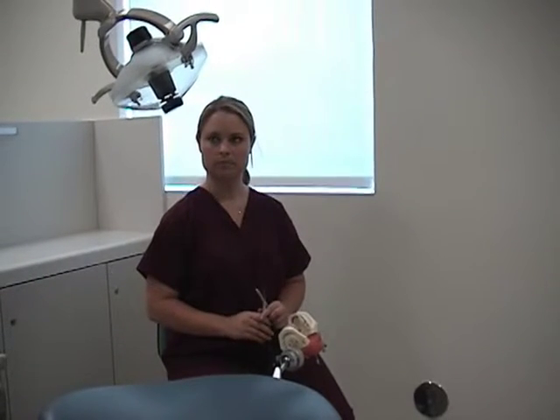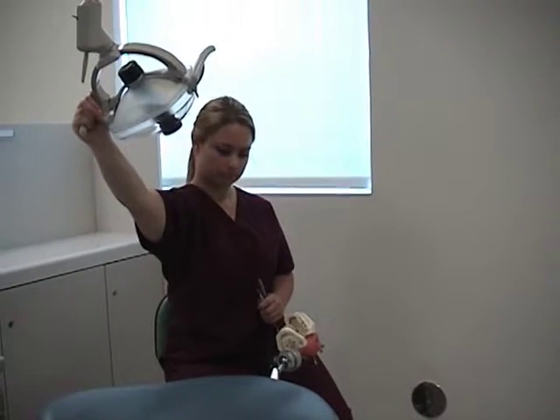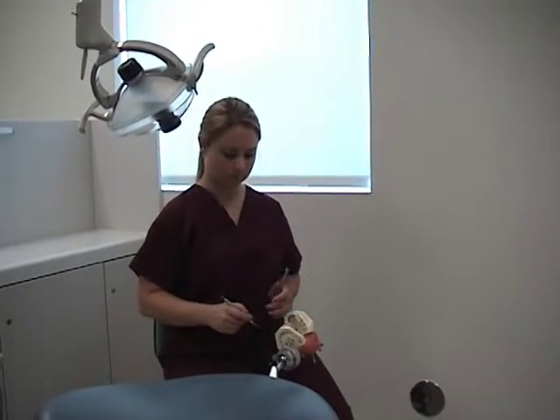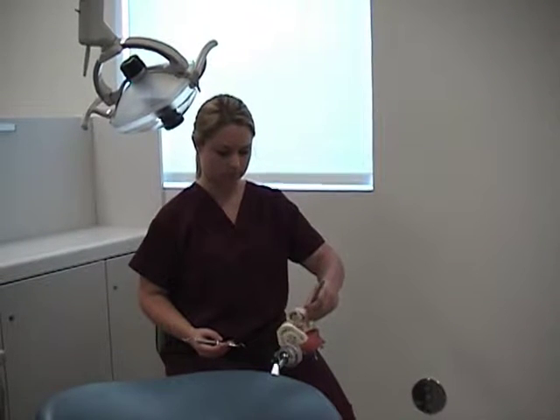Now, adjust the light for your equipment. With your non-dominant hand, establish retraction, illumination, or reflection with the mirror.